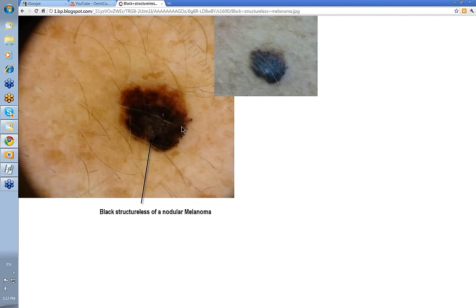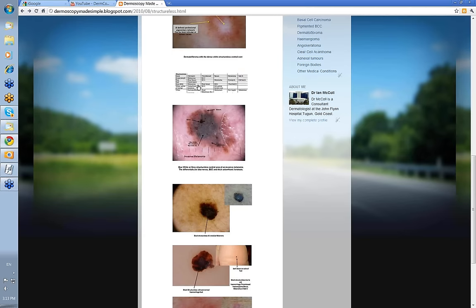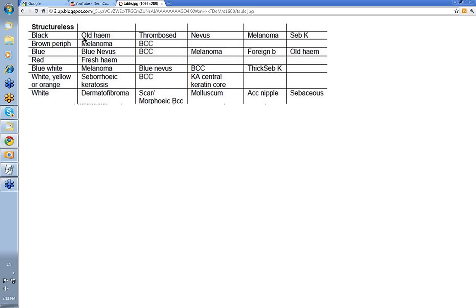Here's a black Structureless area — clinically and dermoscopically, this was a black Structureless nodular melanoma. Black Structureless can be seen in a variety of things: old hemorrhage is probably the commonest cause, thrombosed lesions, some nevi, melanoma, and certainly some seborrheic keratosis.